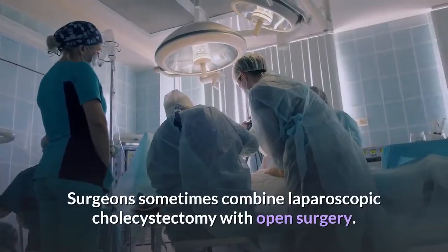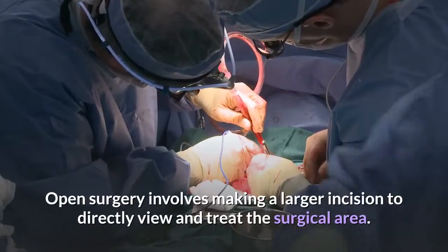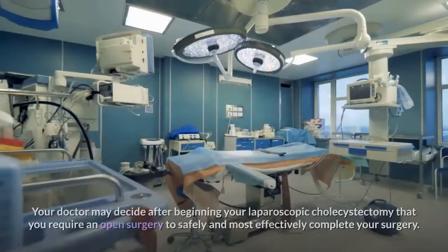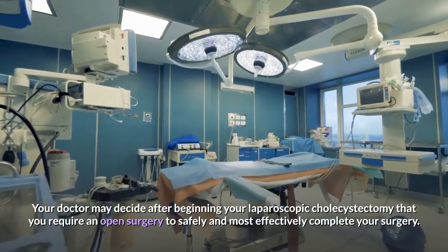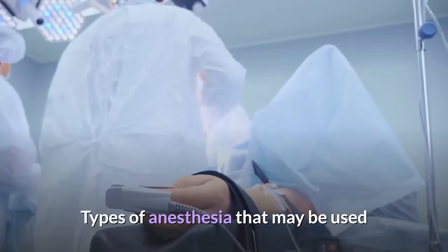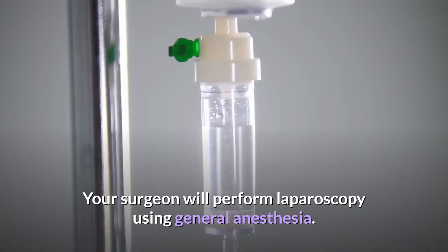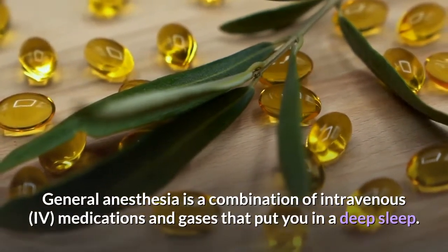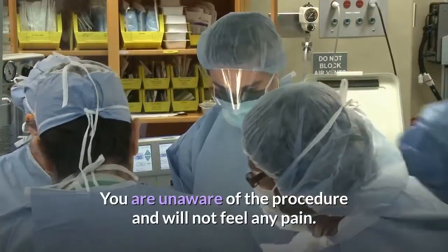Surgeons sometimes combine laparoscopic cholecystectomy with open surgery. Open surgery involves making a larger incision to directly view and treat the surgical area. Your doctor may decide after beginning your laparoscopic cholecystectomy that you require an open surgery to safely and most effectively complete your surgery. Types of anesthesia that may be used. Your surgeon will perform laparoscopy using general anesthesia. General anesthesia is a combination of intravenous, IV, medications and gases that put you in a deep sleep. You are unaware of the procedure and will not feel any pain.